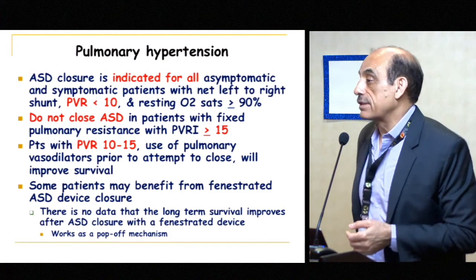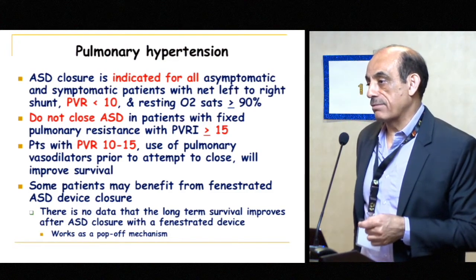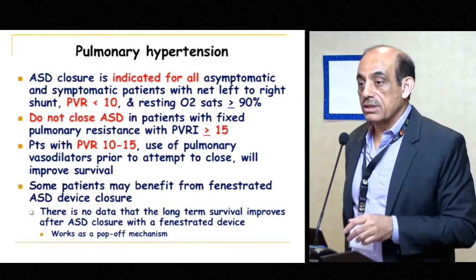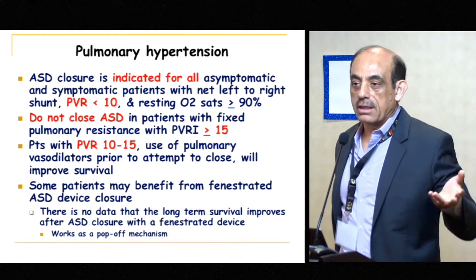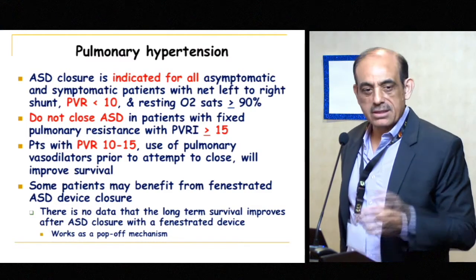You can use a fenestrated device. We used this in 2002, first time ever. I'll be honest with you, there's no data that it helps you, but it protects you from significant pulmonary hypertension crisis. I think I should stop here.